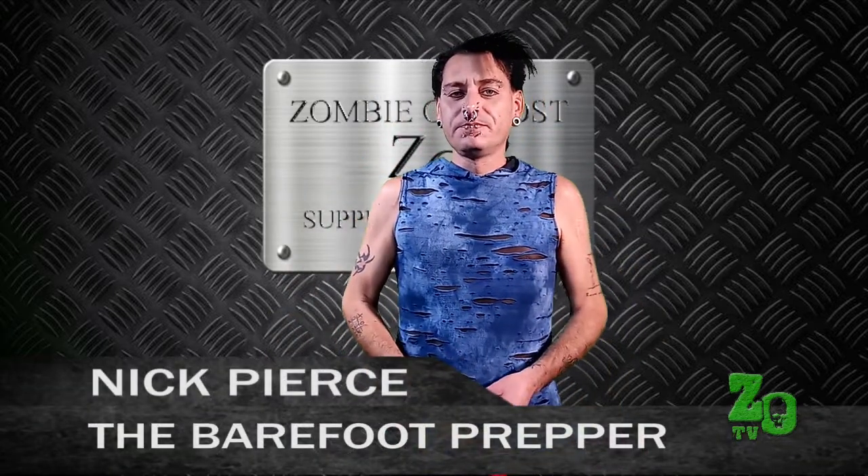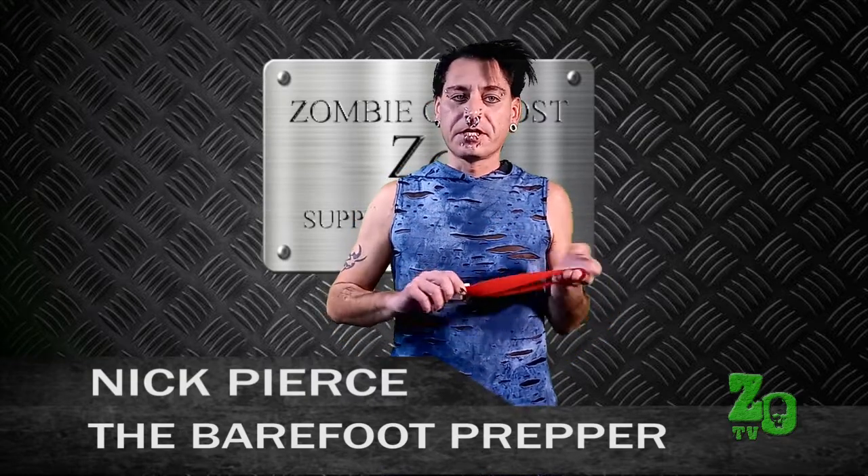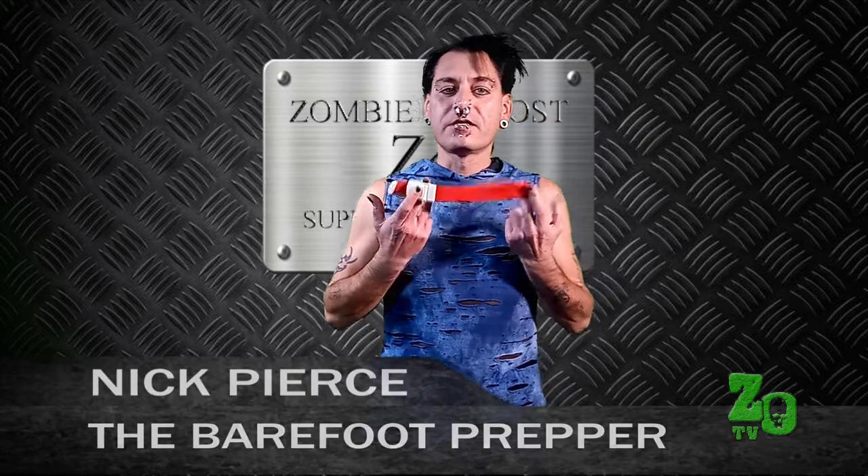Hi, I'm Nick Pearce, the Barefoot Prepper here at the Zombie Outpost and also from R U Ready Radio. I want to talk to you about a very important piece of medical equipment that I keep in my medical kit, and that is this one-handed tourniquet.